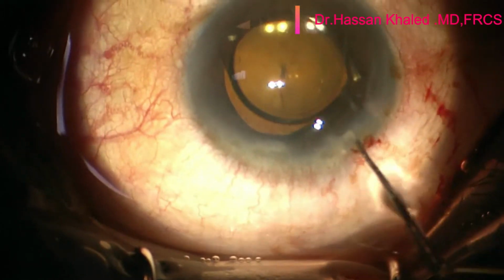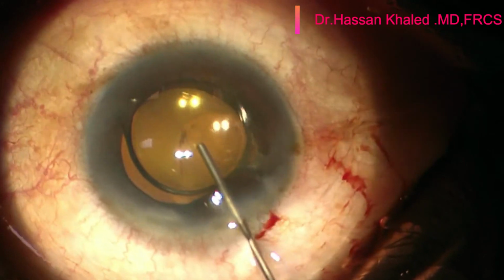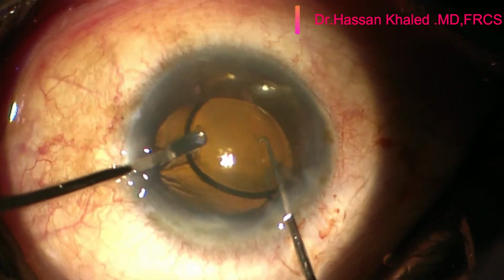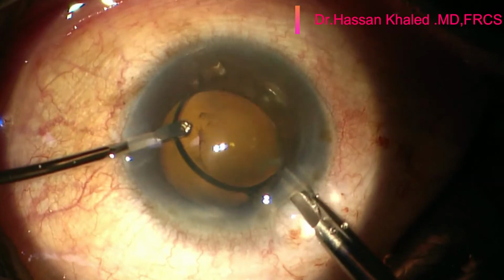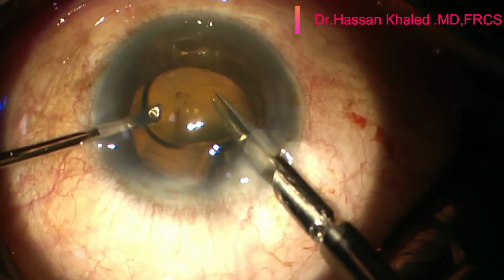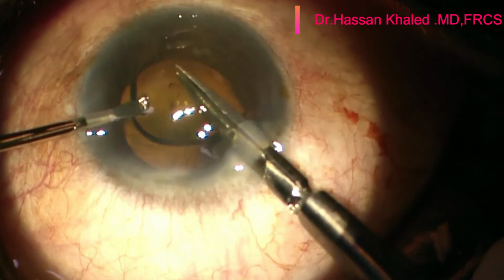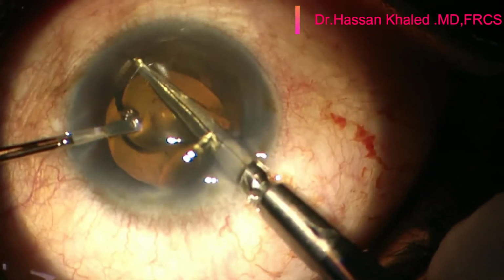Before cutting and removing the old IOL, it is a crucial step to inject a dispersive OVD to protect the endothelium of the cornea before introducing the other instruments, the micro forceps and micro scissors, to cut the old IOL into two halves, as you can watch in this video. Here is the cutting of the old IOL.